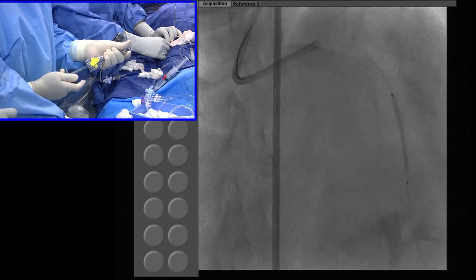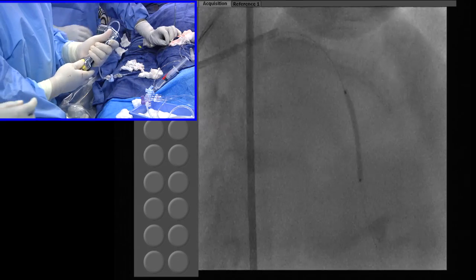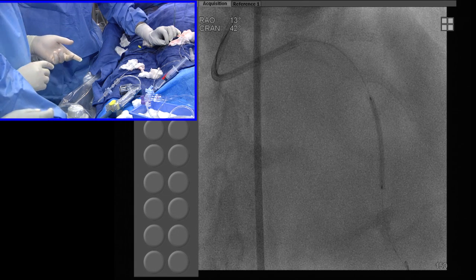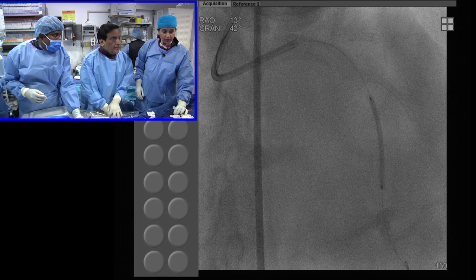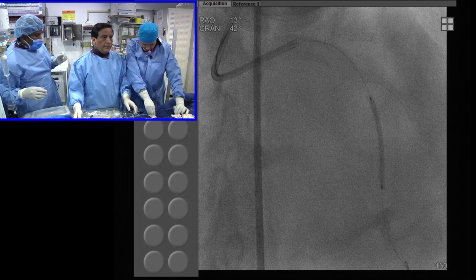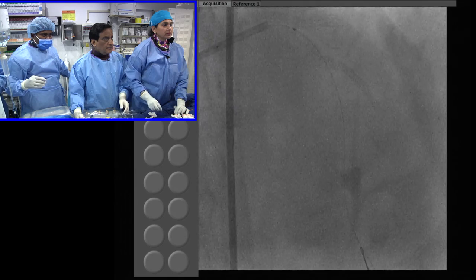Low pressure. Good. What do you want? 2.5? I think we can take a 2.5/32. Is this 32 or 30? Yeah, 32. Okay. The question is where is the dissection? 2.25 or 2.5. Now we are good with everything. Yeah, 32. Good. Bring back in the guide, and let's take a picture. Ready? Ready.